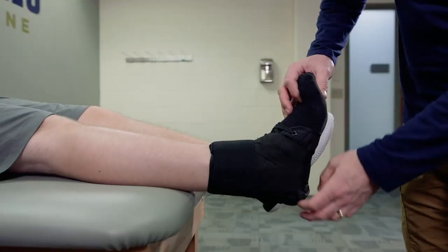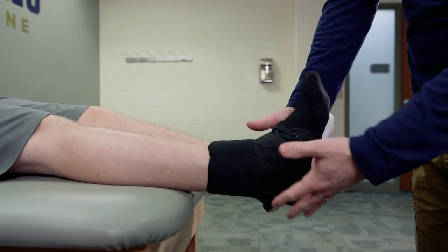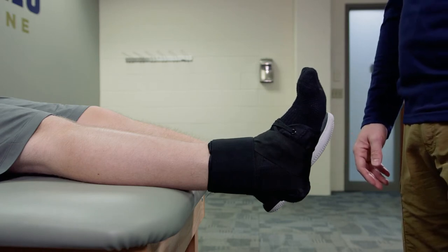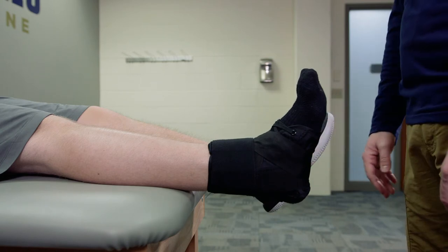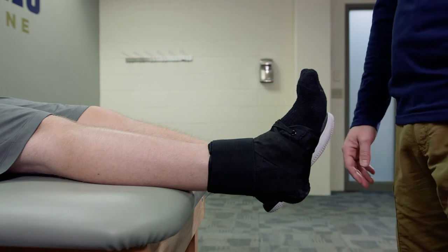Once it's done, just check the brace — make sure it doesn't have any wrinkles or gaps and that it's fitting appropriately. You can have the individual hop up, walk around a little bit, and make sure it's not too terribly tight. You can also check for circulation using capillary refill. As long as it's secure and fits comfortably, the athlete's ready to go.